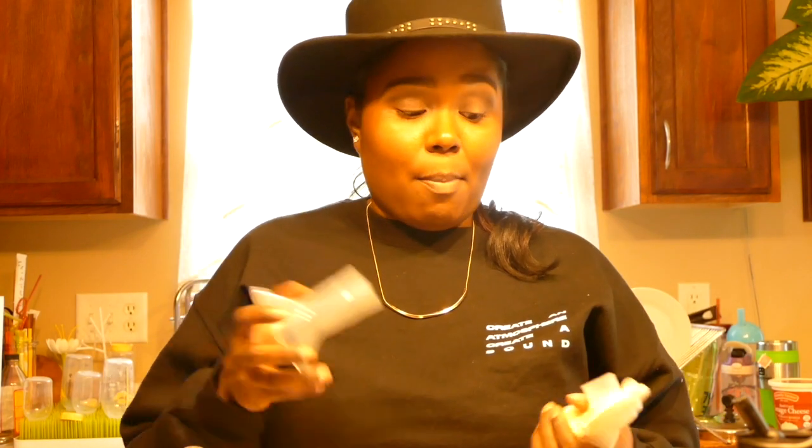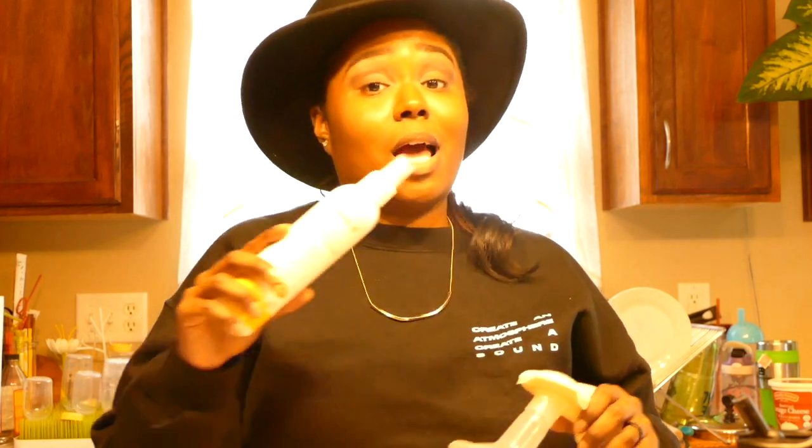So like I said, I'm not gonna pump in the middle of the night, come downstairs, wash, and go back upstairs. I'm just not gonna do it. So basically when I'm done pumping, I'll take my parts apart, I'll wipe them down with a wipe, and Medela also makes breast pump sanitizing wipes as well, but I just use a regular wipe and wipe down everything, and then I'll spray each part with this, leave it out or put it in my little area, and then by the time I'm ready to pump again the next time in the morning, everything is dry, put it back together, and I'm good.